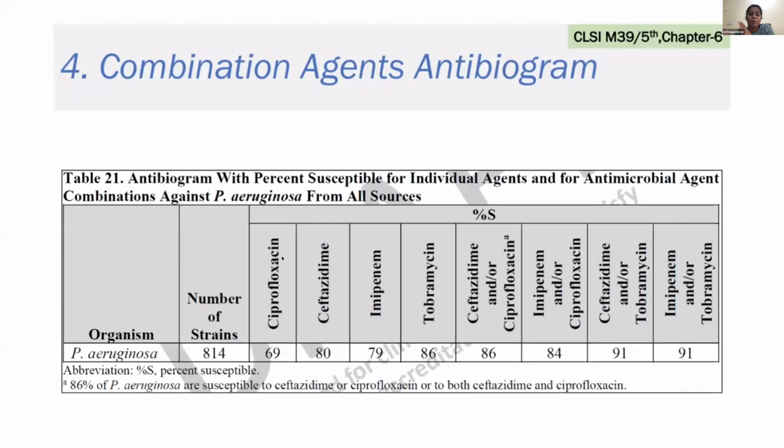If they are choosing a combination therapy, will this be helpful, or what is the percentage compared to the individual susceptibility, can be inferred from this. Again I'm repeating, it does not mean that we are committing on whether they both are synergistic, or that giving the combination therapy is better than monotherapy. We are not committing, because we are combining the susceptibility percentage in the formula of and/or.